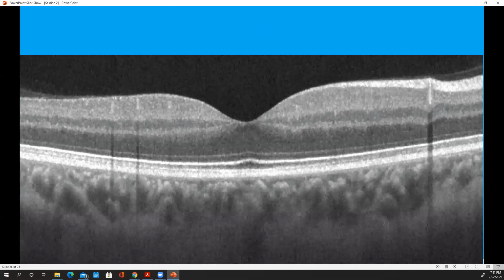I'm going to show you how to determine what is outer now, because that's the question, right? So if we draw a line from across from the fovea, and I always try to do this analogy, and I'm not sure if people like it or not. A lot of people say they like it. I don't know if they're just being nice to me. So you tell me if this works, okay? So here's a line that I'm drawing straight tangent from the fovea.